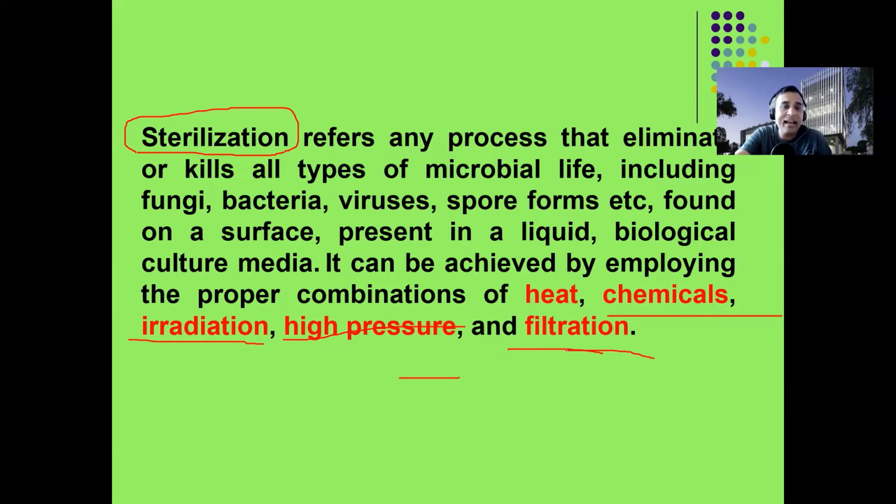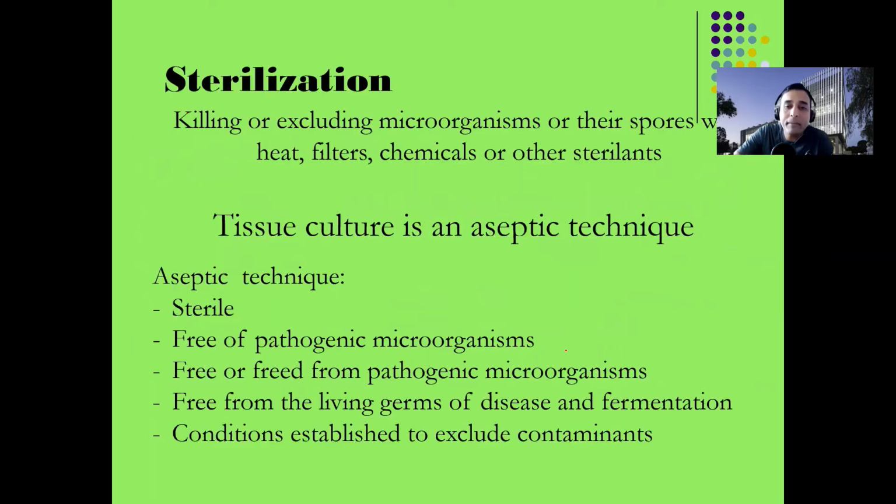Rest of it, whether it is a glass vessel or steel material, without any problem, they can be autoclaved, and they can be sterilized by irradiation also, right? Heat, autoclave or chemicals are used to sterilize your explant material, because explant you cannot autoclave, explant you cannot filter. So the explant plant material that you are using in tissue culture has to be treated by different kinds of soft chemicals, okay. If you use something very toxic, obviously you are going to kill the plant, right?